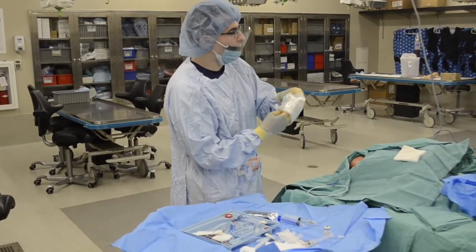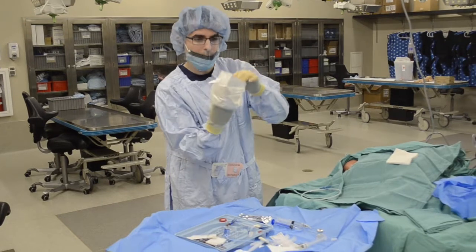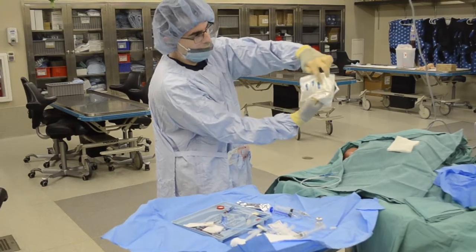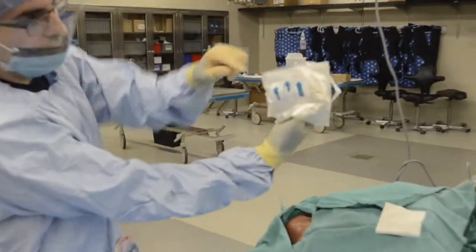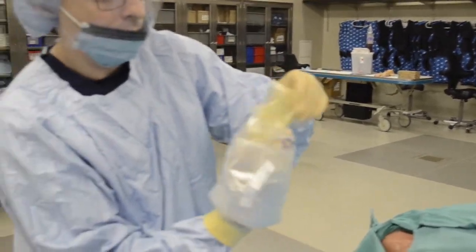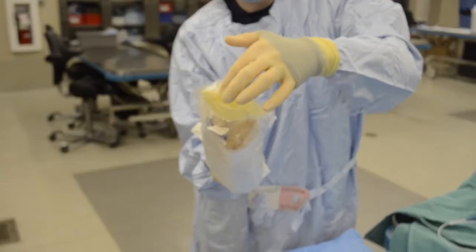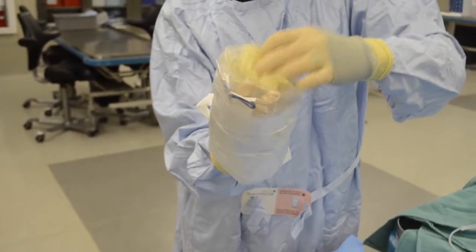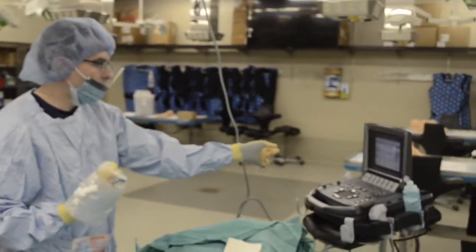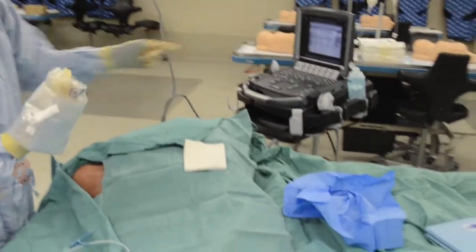So if you're doing this by yourself, you can grab that probe with no one helping you. If someone else is helping you, you have them pull on the white, these little wings. There's arrows here. Your hand goes in, and this is the direction you grab. And basically you're making a little glove. The probe is going to sit right here, in the center of this. Inside, there is non-sterile gel already on our probe, and that helps with the interface.